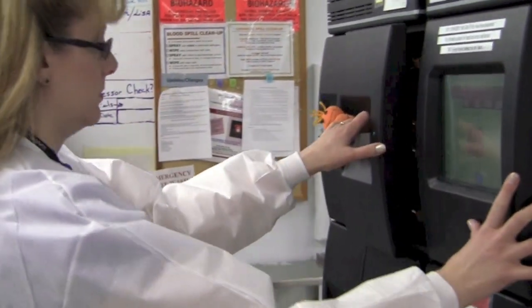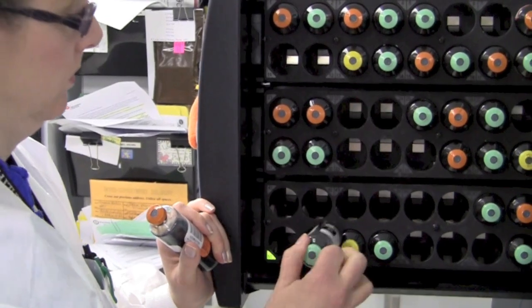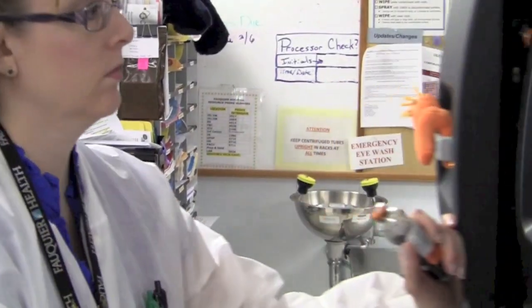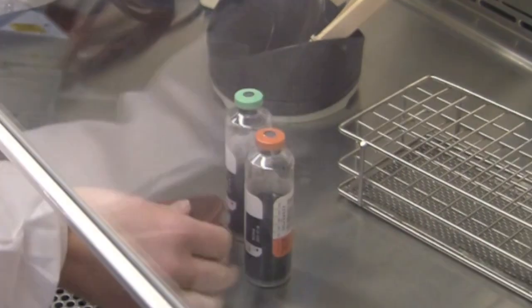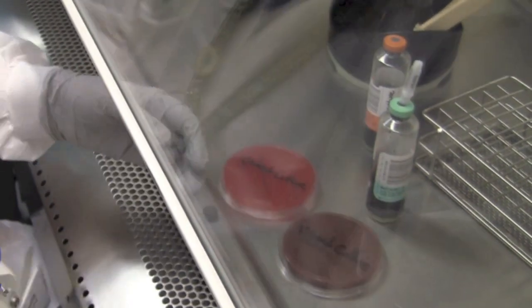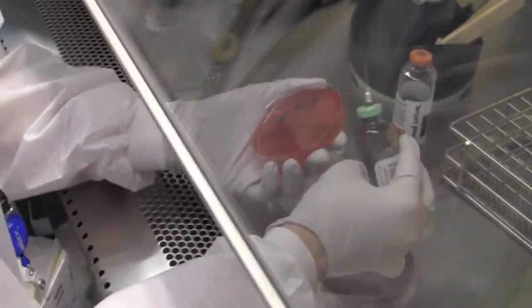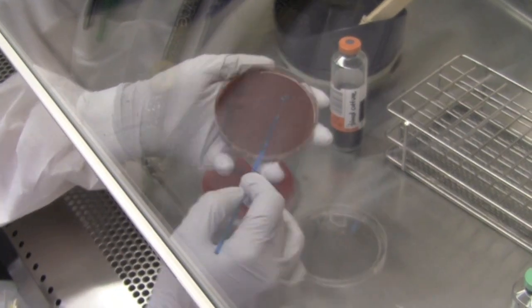Sometime within the next 5 days, blood cultures which have been allowed to incubate are now removed and placed under the hood. Just as with the ear culture swabs, the blood cultures are applied onto agar plates, streaked with a loop, and placed in an incubator to allow for further differentiated growth.